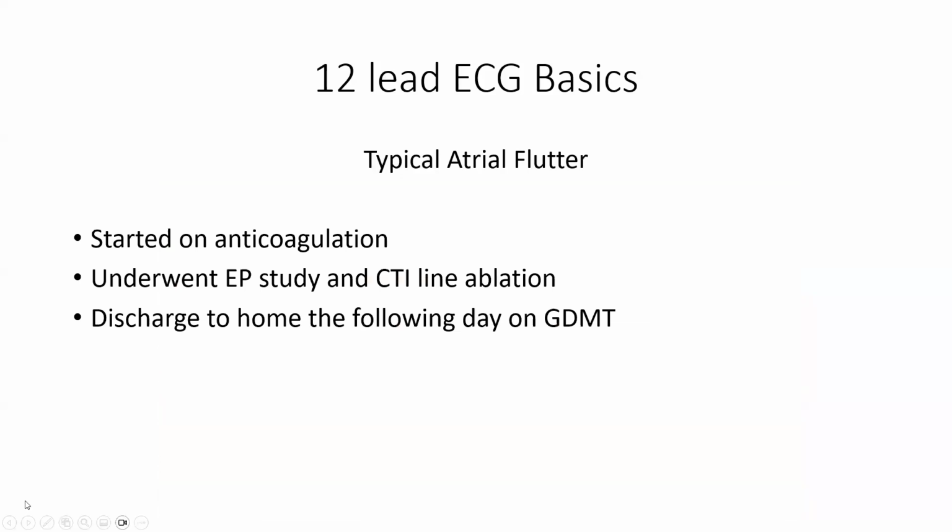This patient was started on anticoagulation and then underwent an ablation for the cavo-isthmus tricuspid line. Cavo-tricuspid isthmus.